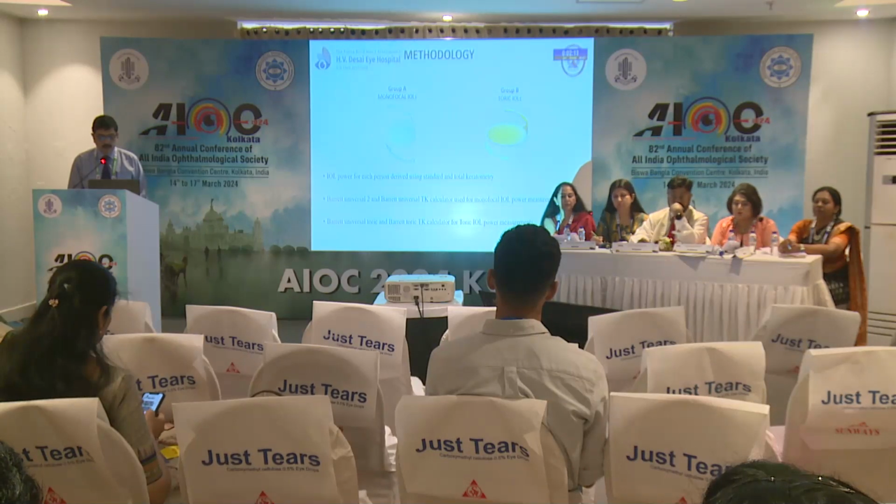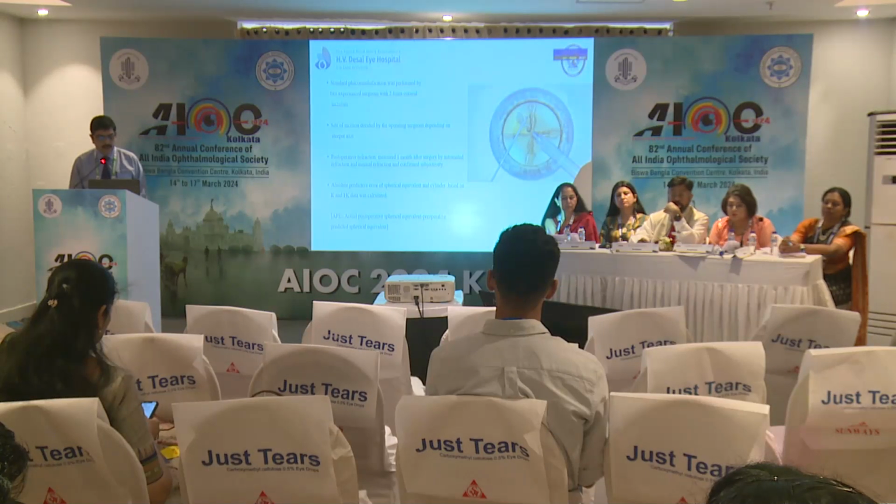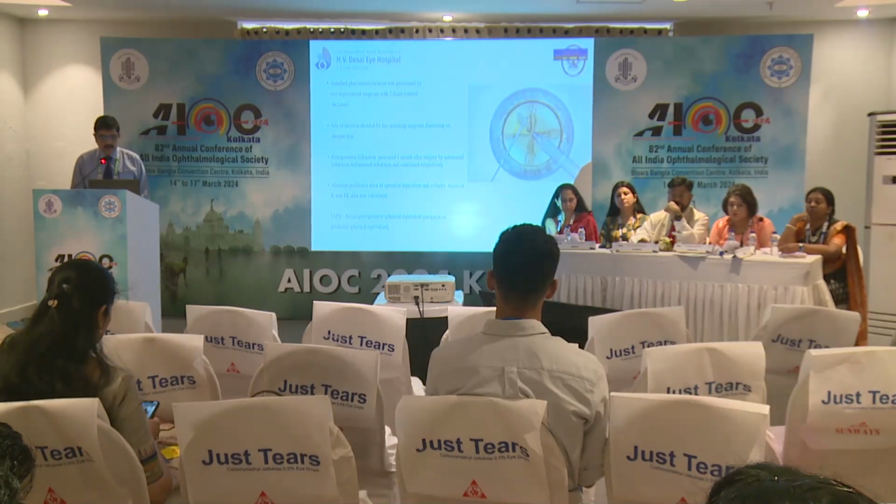We had two groups, one for monofocal, one for toric. The IOL power for each patient was derived using both standard as well as total keratometry. Barrett Universal 2 and Barrett Universal TK calculators were used for monofocal, and Barrett Universal Toric and Barrett Toric TK were used for toric IOL calculation. Standard phacoemulsification with 2.8 millimeter incisions.